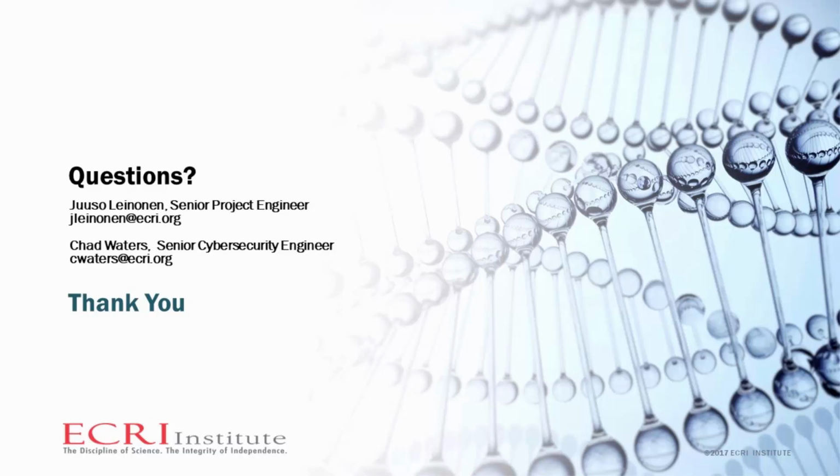This is Yuso. So I would refer to the earlier point on making sure that you have a standard set of requirements, or things you find out about each one of the medical devices you're considering for purchase. ECRI has developed a questionnaire that can help healthcare facilities characterize what connections are needed and what connections are available on that particular device, to facilitate an apples-to-apples comparison in terms of capabilities as well as requirements.